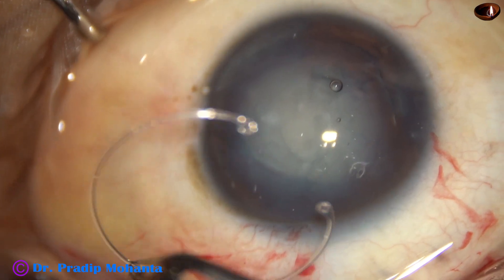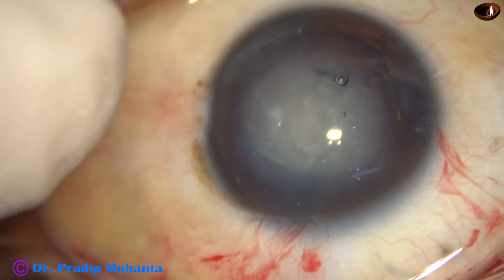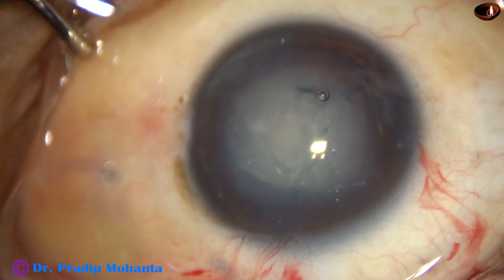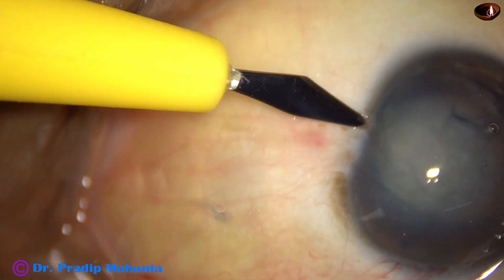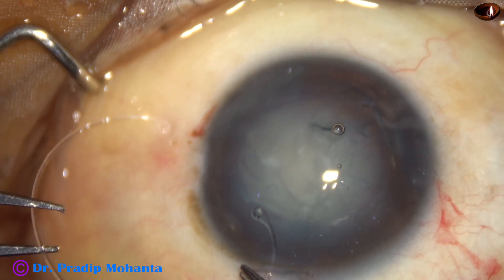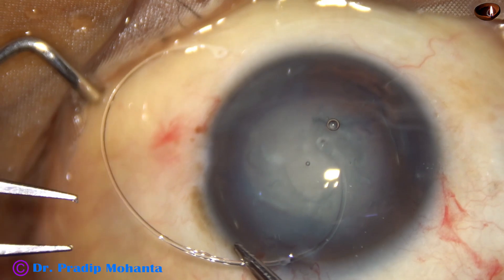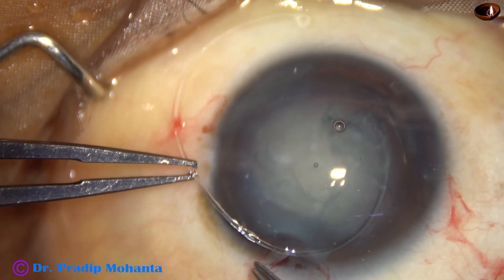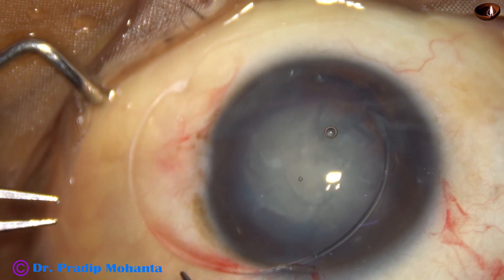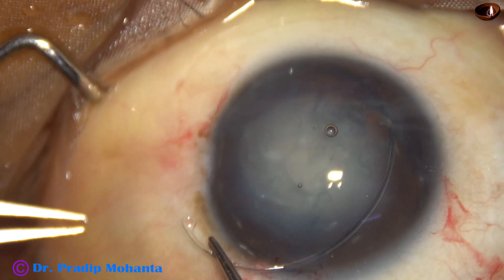And now, the time has come for implantation of the capsular tension ring. At this time, I thought a side port is needed on the left side, so I made a small side port at 4 o'clock. Now, the CTR goes into the anterior chamber. The leading end is guided under the anterior capsular rim, and then it is gently pushed so that it goes along the equator of the capsular bag.